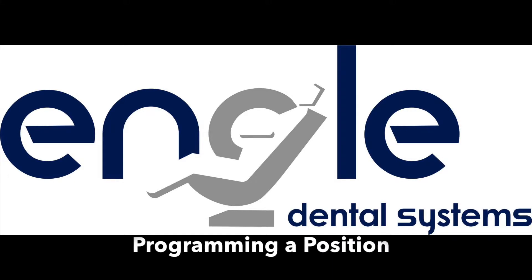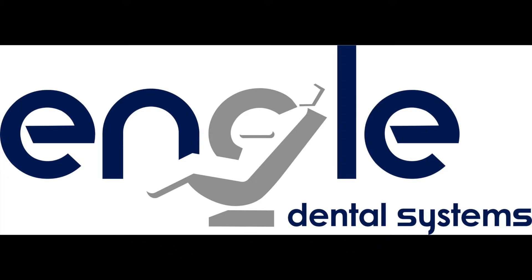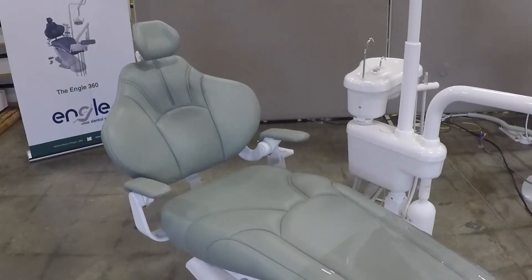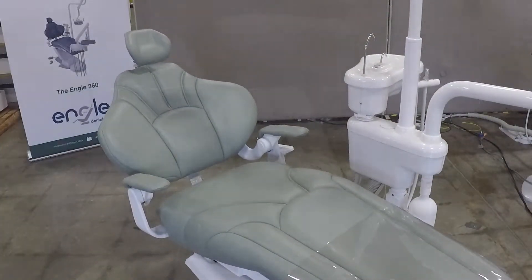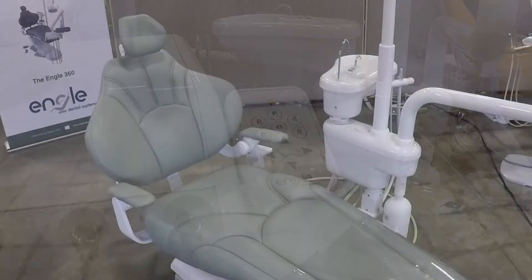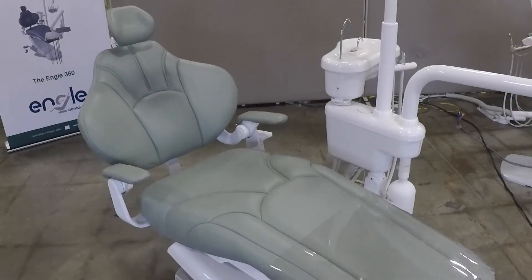To program a position, manually position the chair using the arrow buttons. Once you have finished positioning the chair, press and hold one of the P buttons. Once the chair beeps, release the button. The chair will now return to that position anytime the P button is pressed.